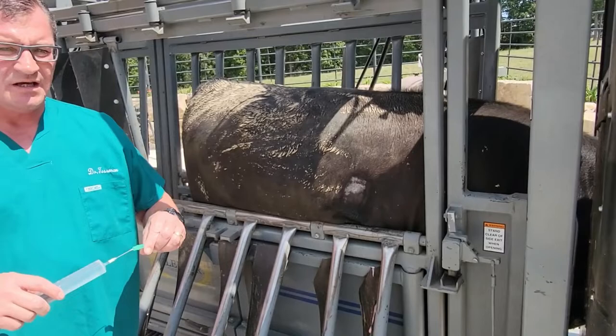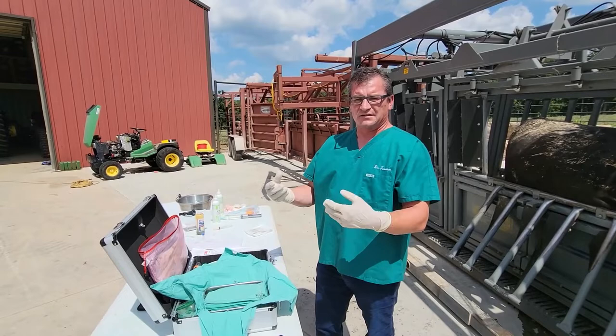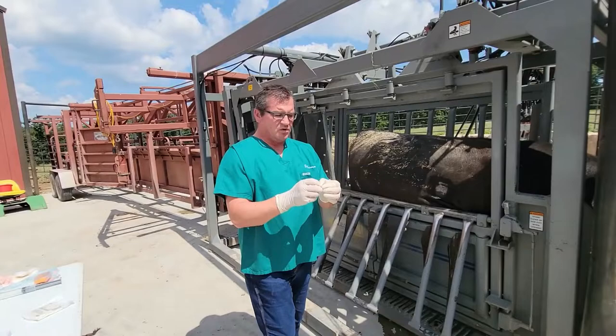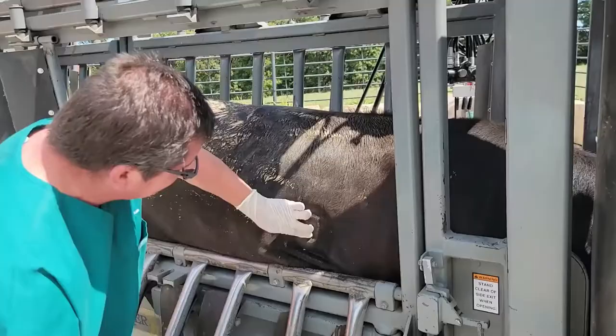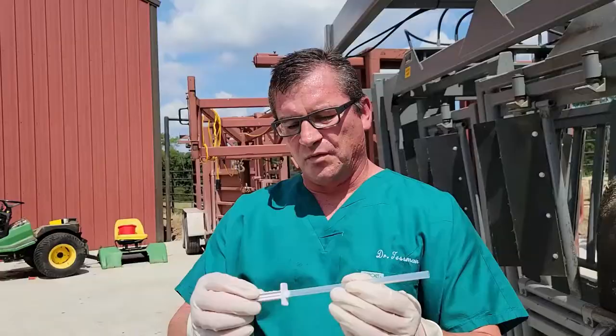Usually I use between three and five mils depending on the size of the animal. I use sterile gloves, but you don't have to — it just encourages cleaner technique. Then take a scalpel, identify your bleb, and do just a little stab incision through the skin.